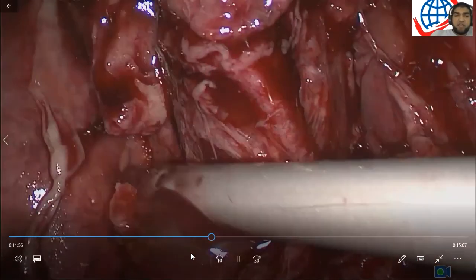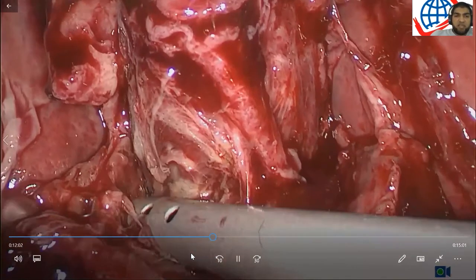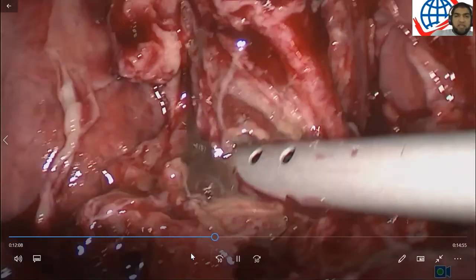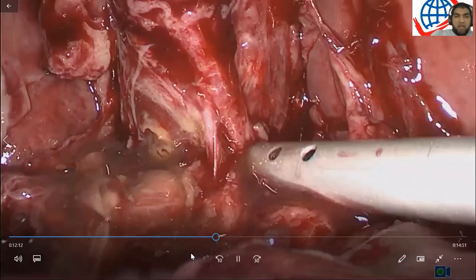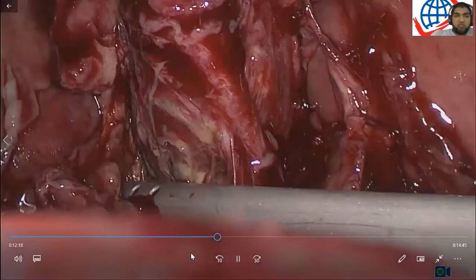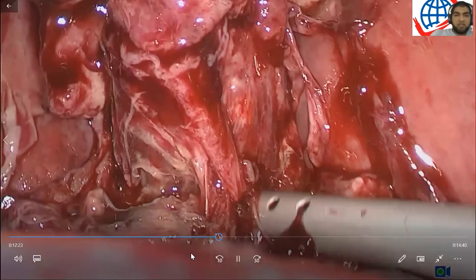This area of the dissection was quite hazardous. We assumed, and you can see from the exudate in the surrounding tissues, it looks like a local area of perforation. And you can see here that all the pus mixed with bile is oozing in this area. So the suction comes in handy because as the pus oozes out, you suck it up and you dissect also with the same instrument, and you can irrigate simultaneously as well.